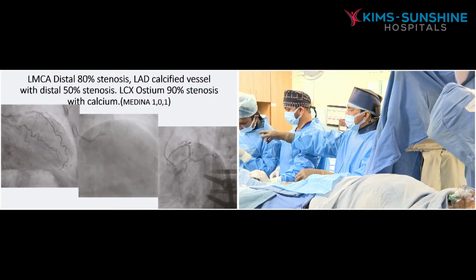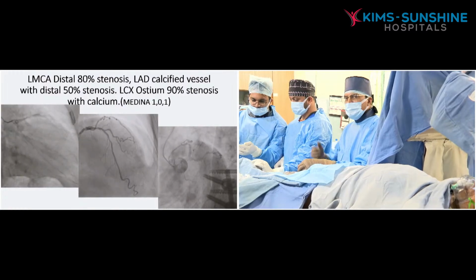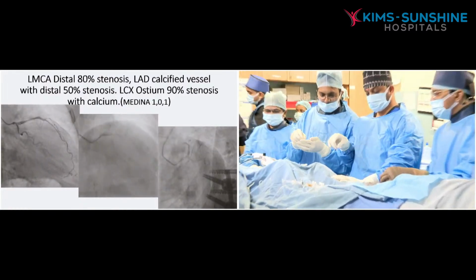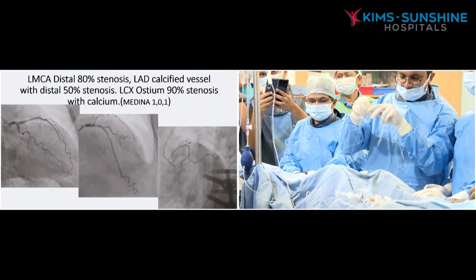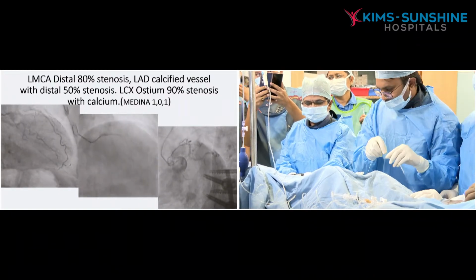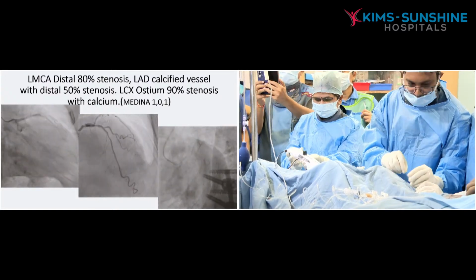You can see the advancer knob. You can show the advancer knob. Brother, you just zoom that one. There only go. I'll zoom.